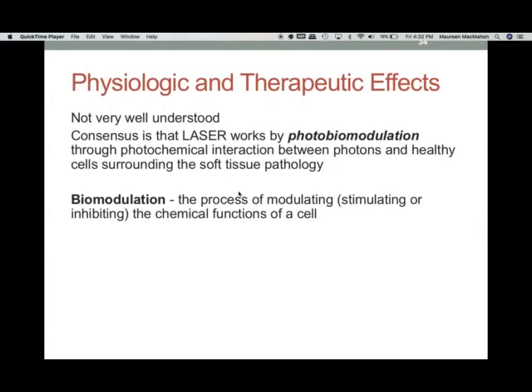I hope that helps you to understand a little bit more what the acronym LASER means. So again, laser means light amplification by stimulated emission of radiation. So we know how it amplifies, how the photons are being stimulated for emission of other photons, and then how all that comes together to make that laser beam. Okay, so now that you know how it's created, how it's generated, now we'll see how it works.